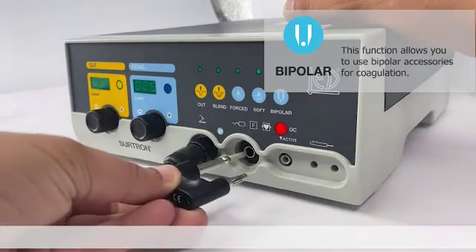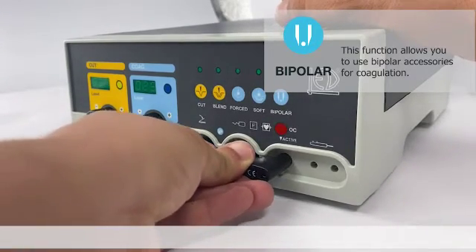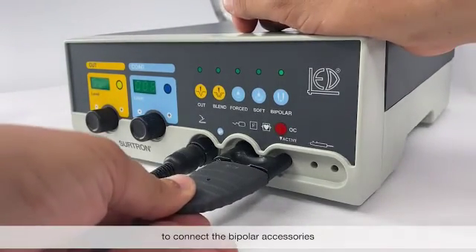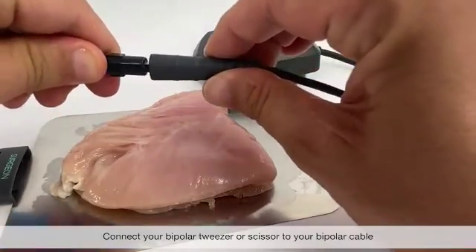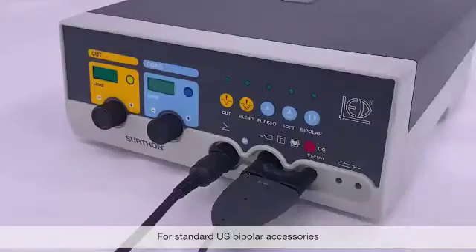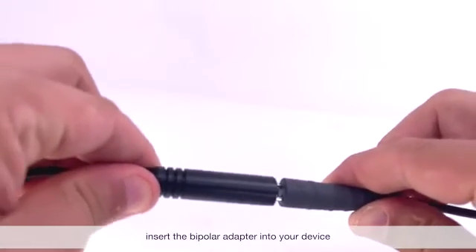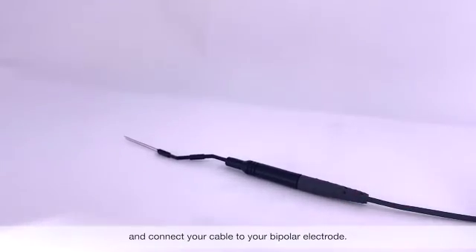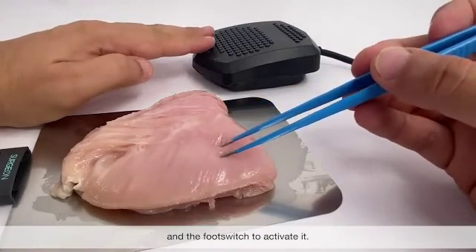Bipolar: this function allows you to use bipolar accessories for coagulation. For bipolar, you will need to use an adapter to connect any bipolar accessories. Connect your bipolar tweezer or scissor to your bipolar cable. For standard US bipolar accessories, insert the bipolar adapter to your device, then insert your bipolar cable and connect your cable to your bipolar electrode. Press the foot switch to activate it.